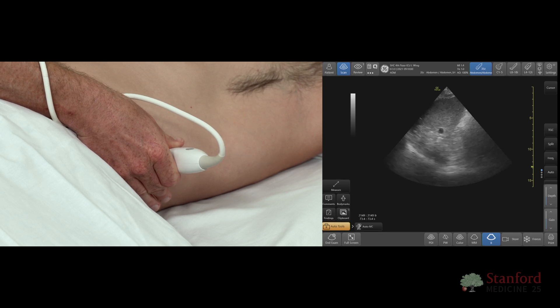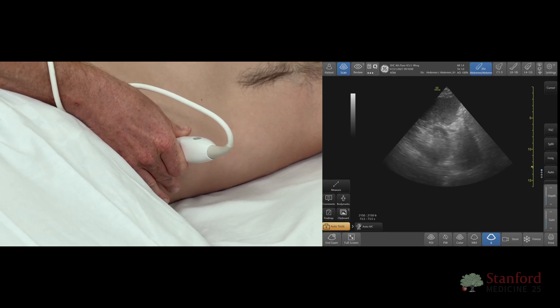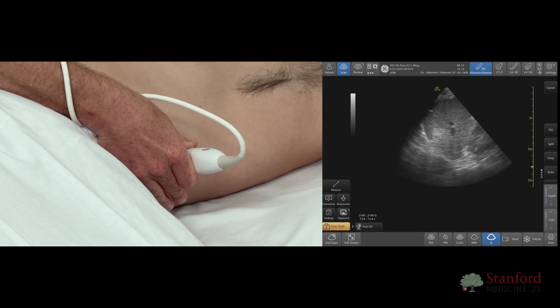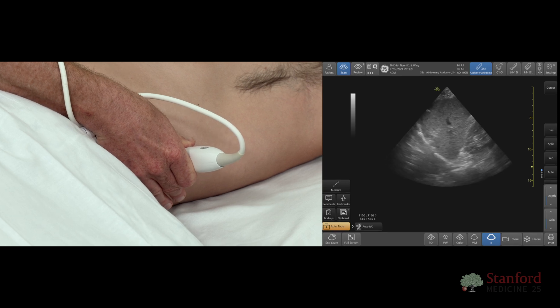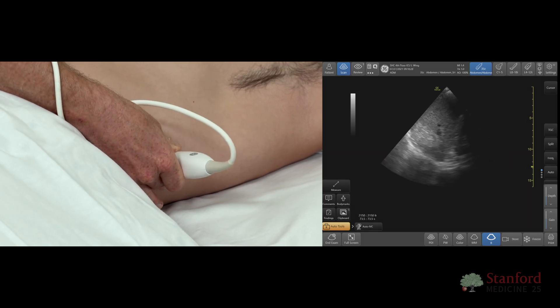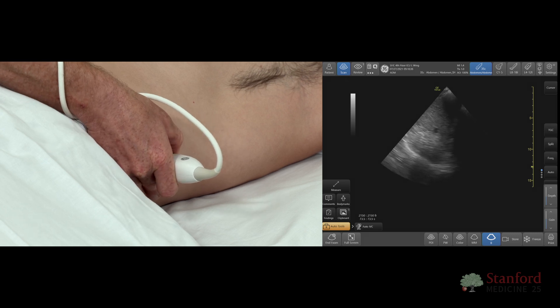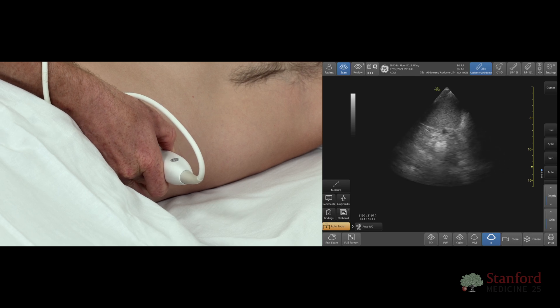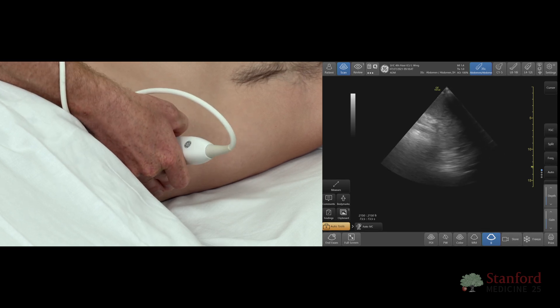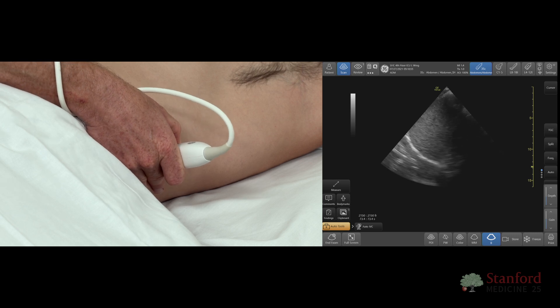The first thing you need to know is the probe movements. When you place the probe on the patient, you're going to slide around until you've got a picture you like, then anchor your hand and do your other movements. First, there's fanning the probe — that's moving perpendicular to the beam, going anterior and posterior back and forth. Then there's rocking the probe, where you move parallel to the direction of the beam; for example, rocking to send the beam further superior into the chest, or rocking inferior. Finally, you can rotate the probe, or compress by pushing down. Those are the different motions you need. Now you're ready to actually go ahead and look for a pleural effusion.